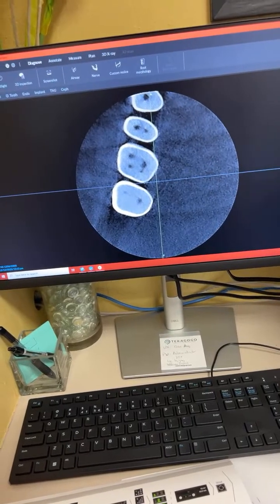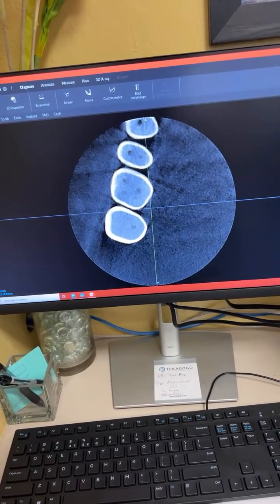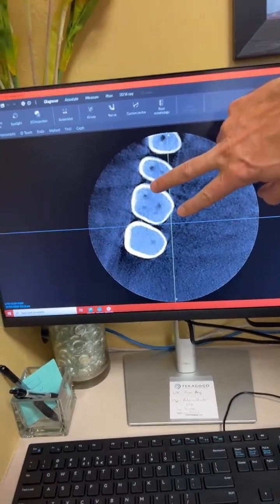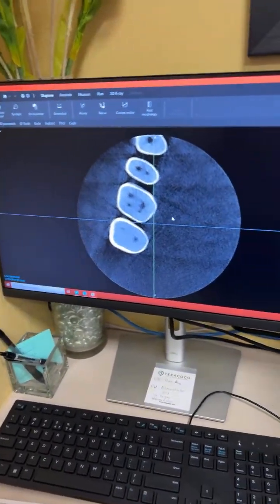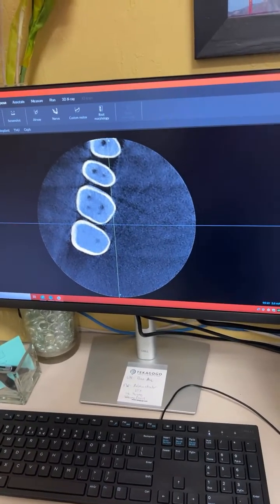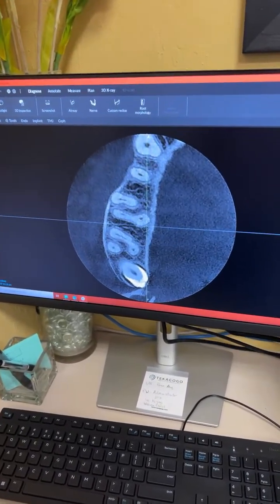You do that. Hey guys, take a look. You have four canals. Yeah, that's clear as day. You see that fourth canal? An auxiliary. See that fourth canal? One, two, three, four canals. That means that you are a champion. Most people don't want to do four canals. They take too long. Clear as day. Look at that. Wow.